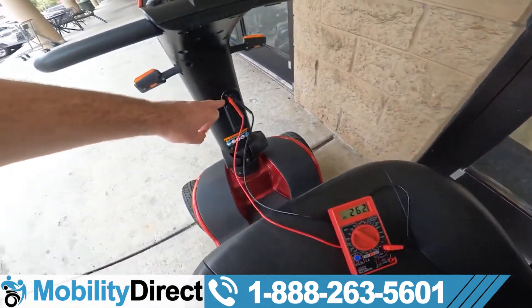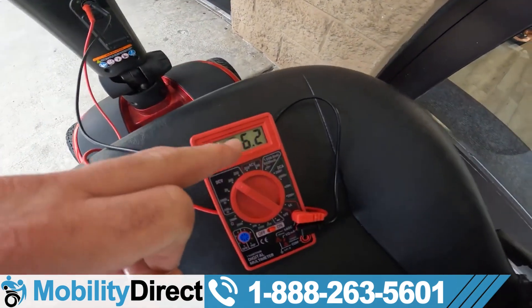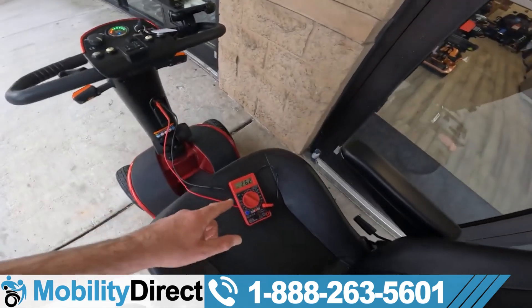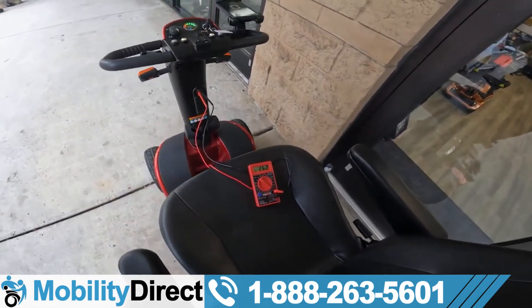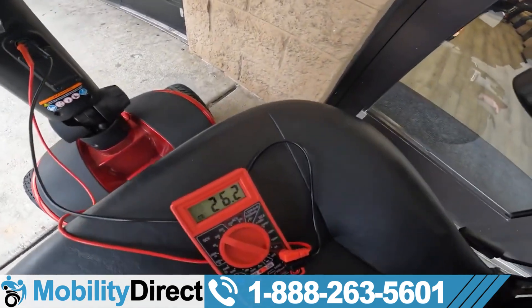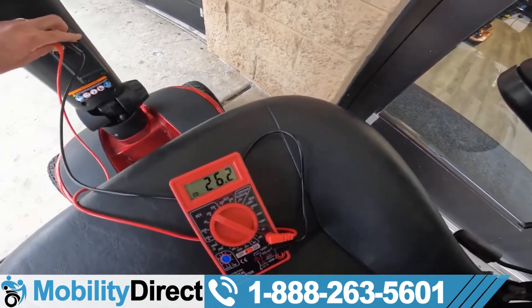You need a cheap little multimeter. Plug it into your XLR port and turn it on. We got 26.2 volts — this is pretty much a fully charged scooter. Now when you get on the throttle, you should see your voltage go down gradually, not quickly and rapidly. So we're going to get on this scooter, give it some throttle, and we'll see what the battery meter tells us.